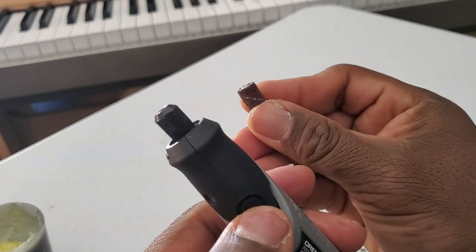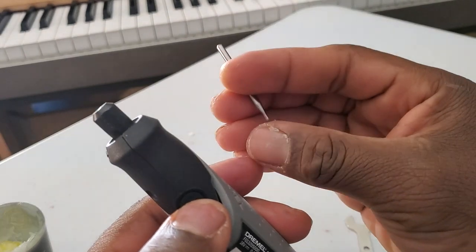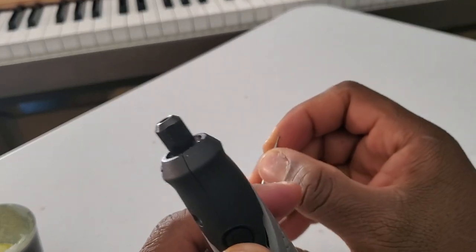You want to use this kind of rough sandpaper attachment. And then that's the polishing unit. And this other one is for picking up little bubbles from your denture.